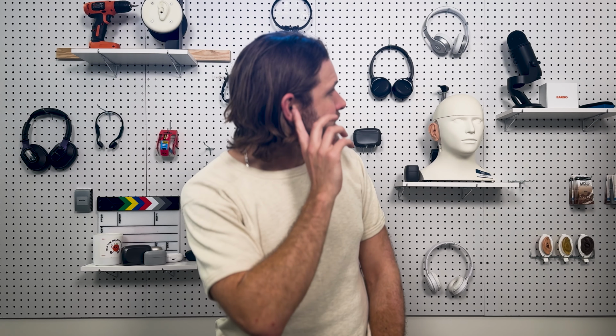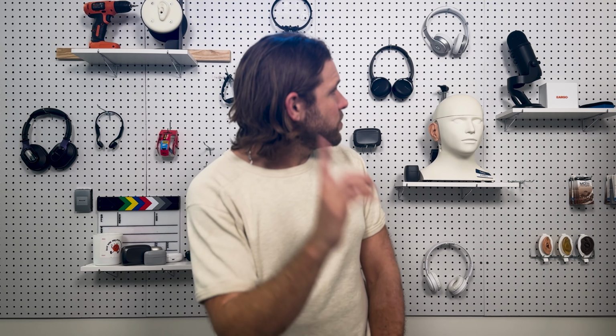Now, a couple of other important things to note before we talk about sound quality, which I am sure is what many people are very interested in as a comparison between these two products. The first is comfort and size. So Sony CRE-C20 hearing aids sit all the way down in the ear. If you look straight down my ear canal, you might see them. They have this little tab, which allows me to pull them out of my ear. But in general, very few people are going to know that I'm wearing this hearing aid.